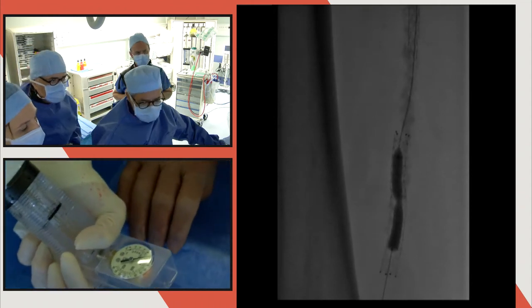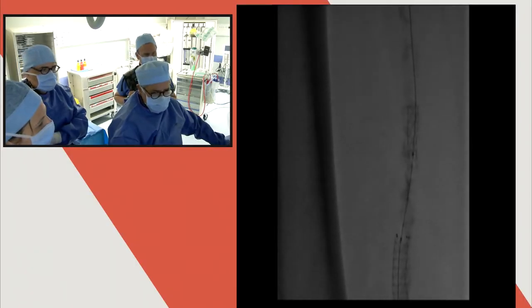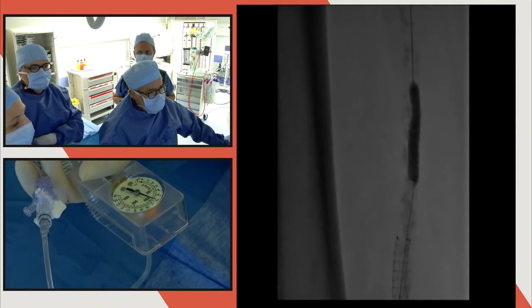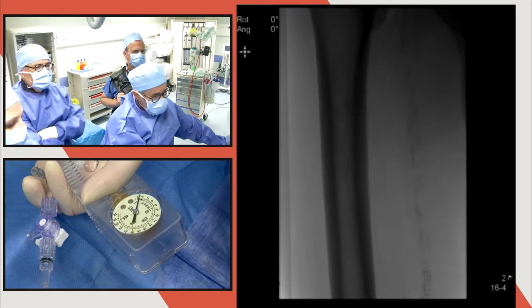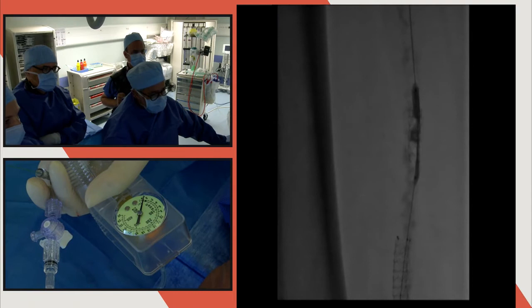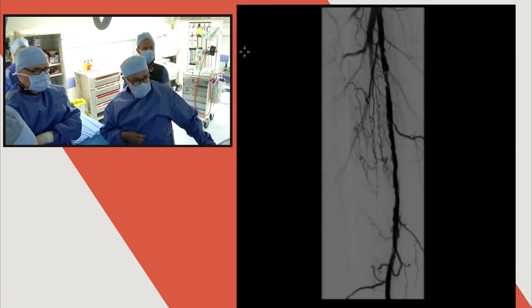It looks as if the stent is a little bit not in between. Here, it is diseased, more proximal, but it was not relevant. 12, 13, 14. Because you see, we had a lesion above, huh? Yes, of course. But we will stent it anyhow. So all diseased. But you don't prepare the lesion? I don't do it, but you can do it, of course. Okay. Wow. It is not bad, huh? It's already a good result.